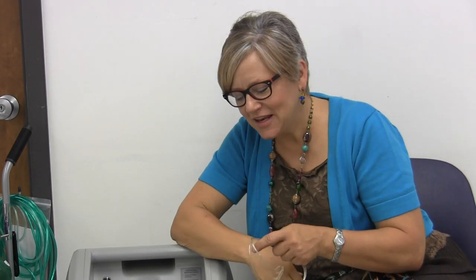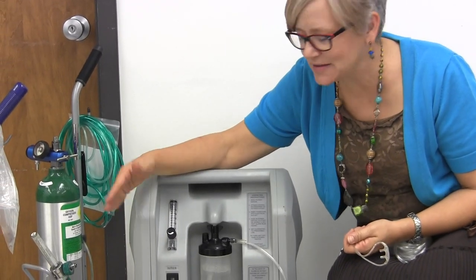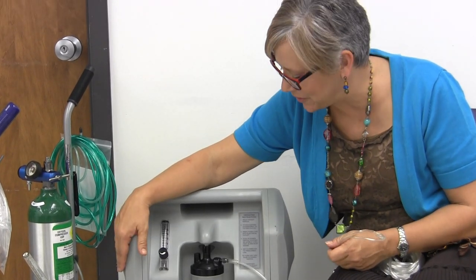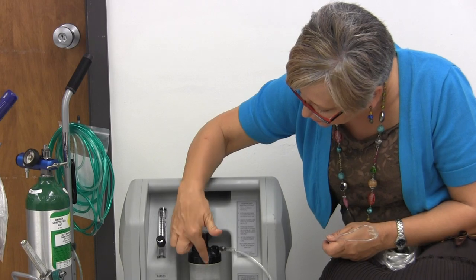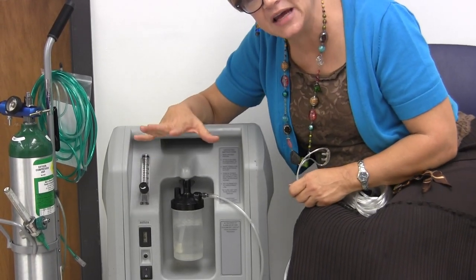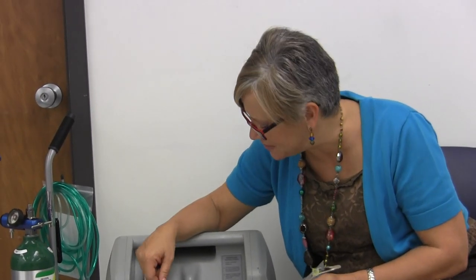Hi guys, it's Diane again. Today we're going to talk about oxygen and some important little tidbits. I'm here with a concentrator and an e-tank — everybody's seen this or a similar situation with their oxygen concentrators. You see you have your bubble humidifier bottle. I thought I'd talk about some things I see frequently that people maybe are doing wrong, and some tips that might help you.